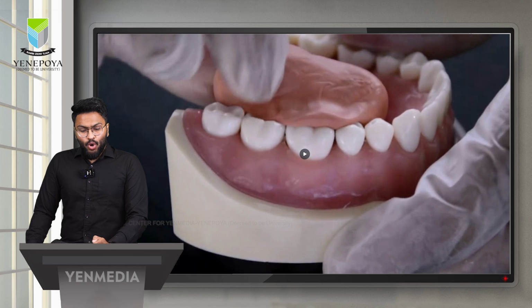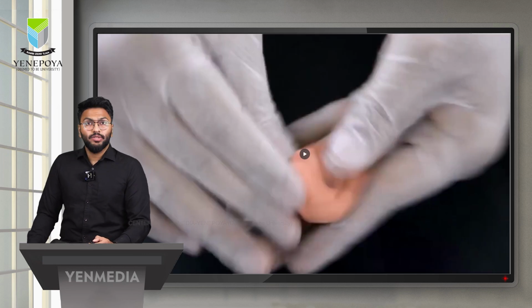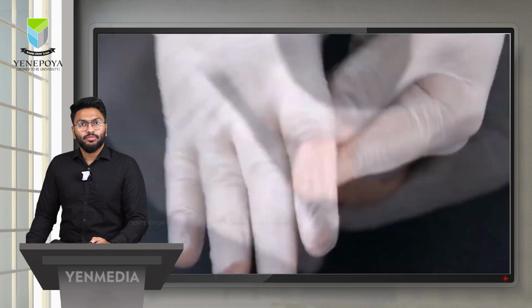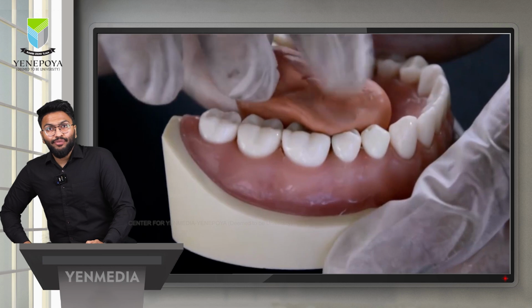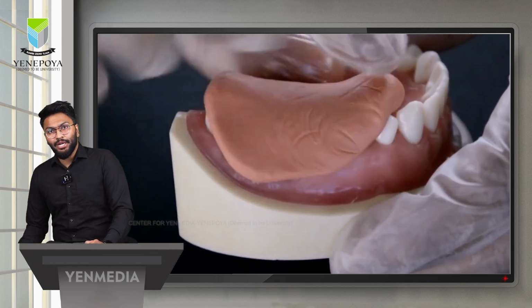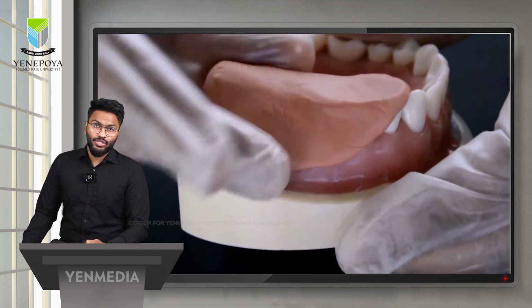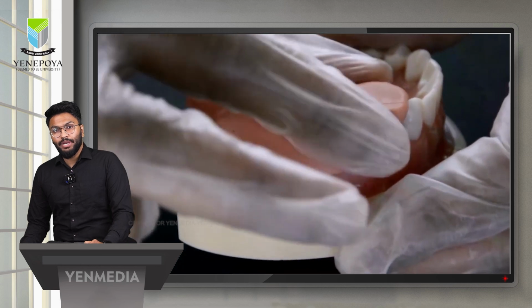I will be playing a small video regarding the direct technique. As you can see, the putty is being mixed. Here the typhodont refers to your patient's mouth. So the putty index is made before the preparation. This is your direct technique. So before the preparation is made, the putty index is made in the patient's mouth.